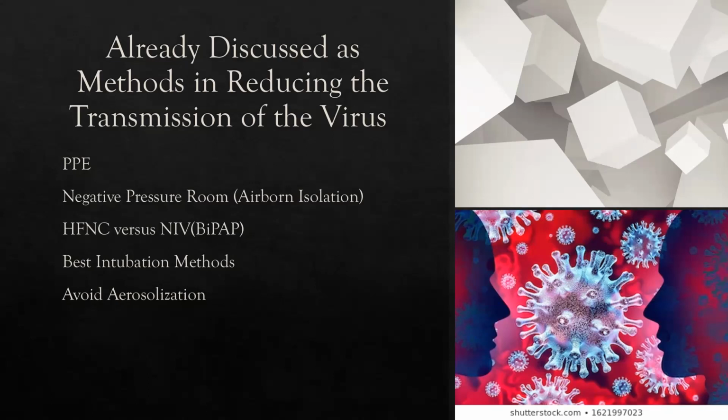And then patients that are COVID-19, giving them a nebulizer treatment. They breathe in the aerosol and they blow out the aerosol. And now they can have suspended virus on those aerosol particles and it spreads throughout the room. So they were changing that to MDI, trying to avoid giving COVID patients a nebulizer treatment.